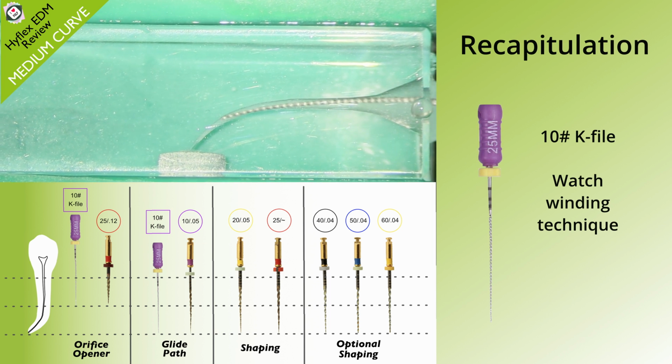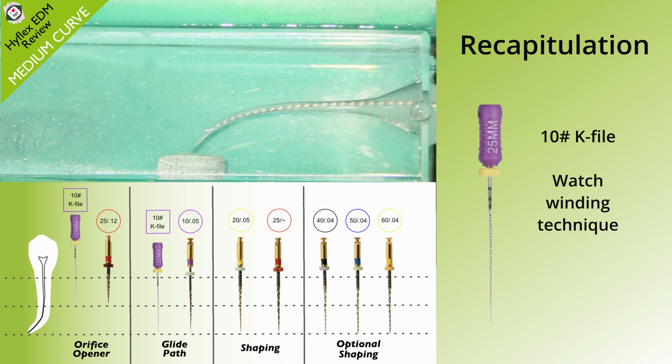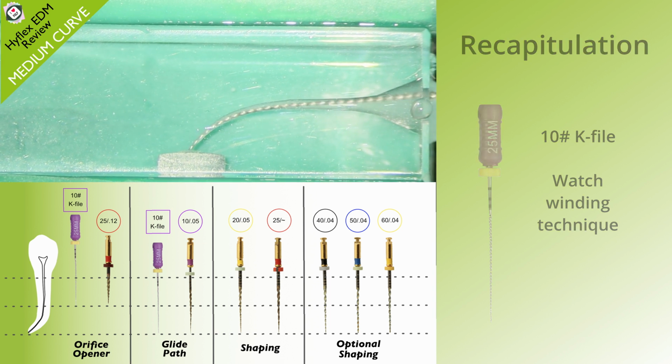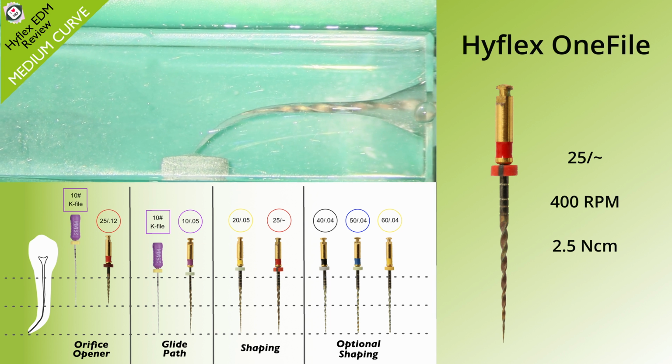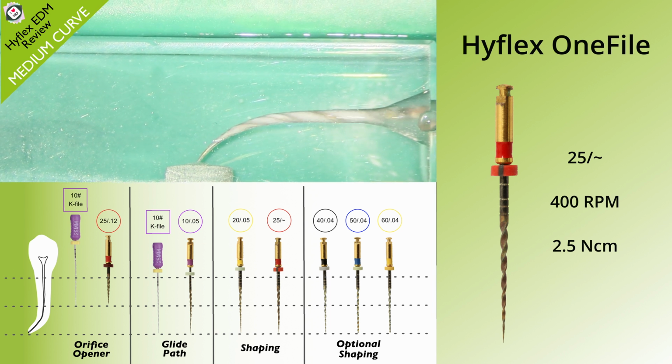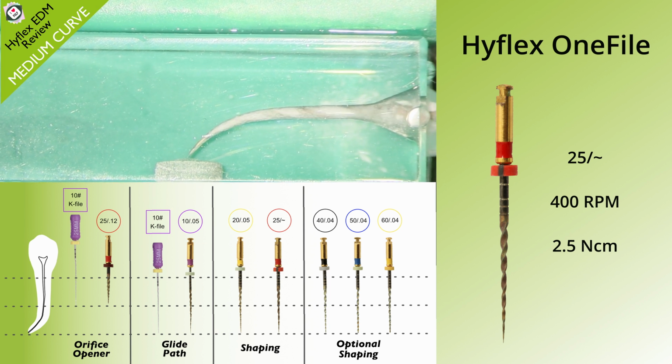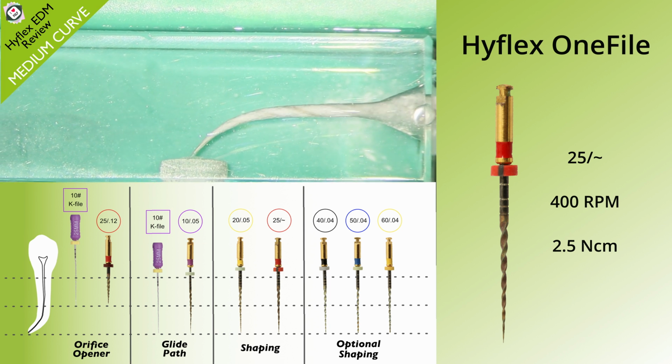So I didn't get quite to length with this size 20 file. So again, I'm just going to remove the debris and get to length, and again, lots of irrigation and recapitulation. Notice the debris is all removed now. Using those Hyflex tips is quite useful in this case.